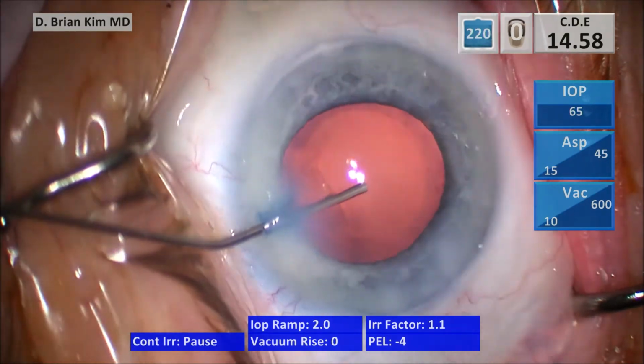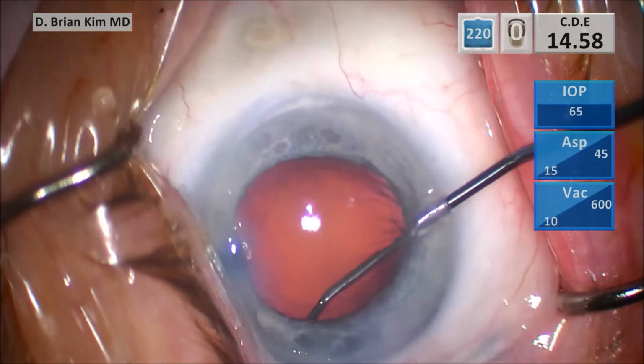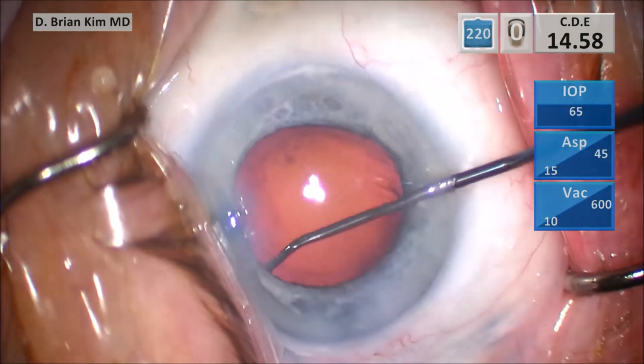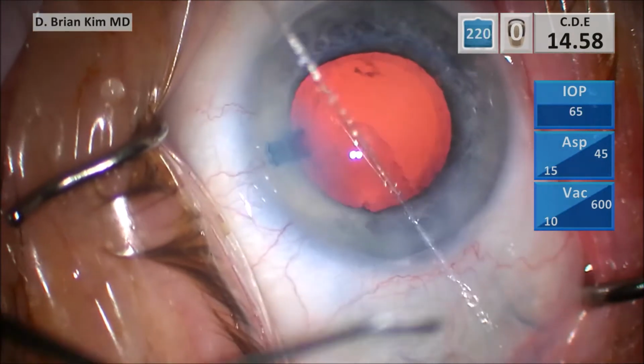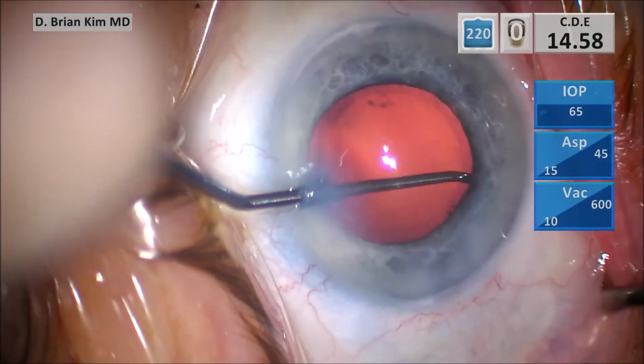Pushing cohesive viscoelastic to fill the bag. And then I'm polishing under the rhexis edge, sweeping with the sweeper, removing the lens epithelial cells. And again, if I felt like there was more lens material, I can sweep a little bit deeper into the capsule fornix to pull and peel really stubborn lens pieces out of the bag.